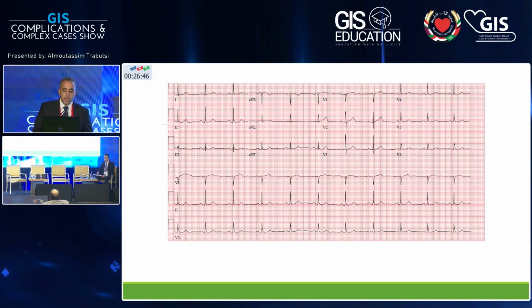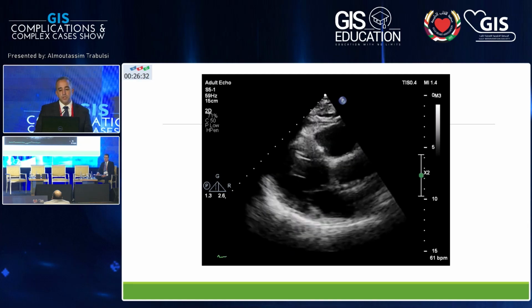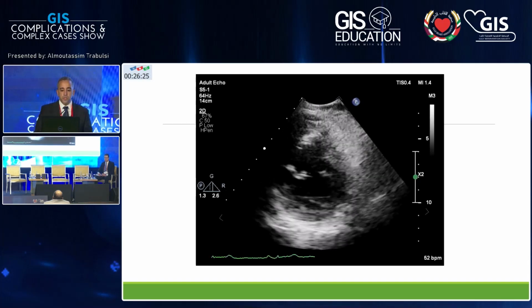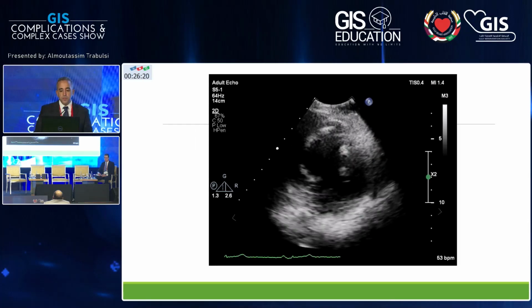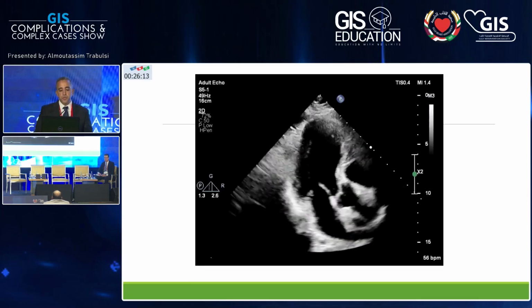This is his ECG on arrival to our hospital, and that was in August of 2022. So that was 3 months after his initial presentation. His echocardiogram did not show any significant valve abnormality. Has a normal left ventricular function, 50 to 55%, with no wall motion abnormality. His RV was also normal function and size. His apical four-chamber also showed a normal left ventricular function.